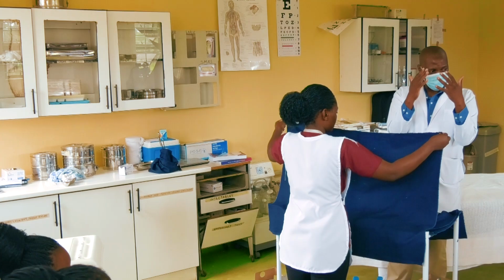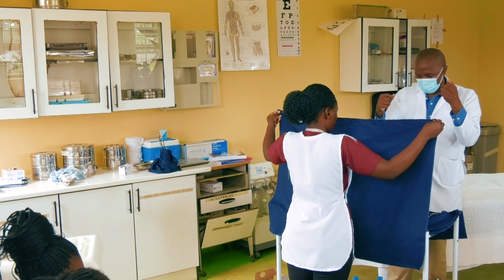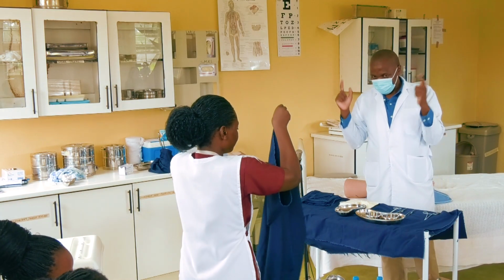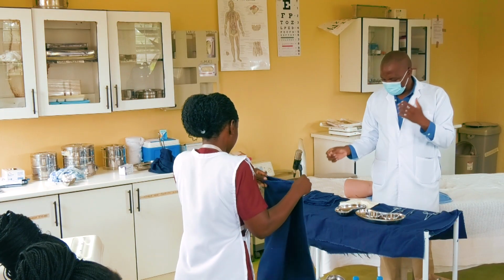Remember I'm scrubbed, right? Lift it, fold it, and throw it in the box down here. You lift and move away from this whole place. So what do I need here? The first thing I need here is what?